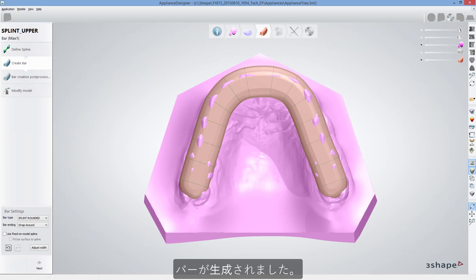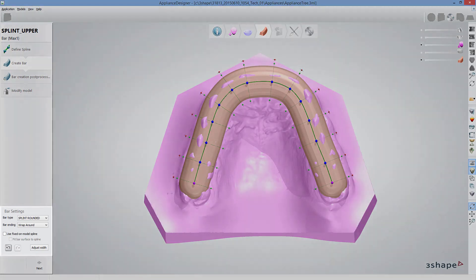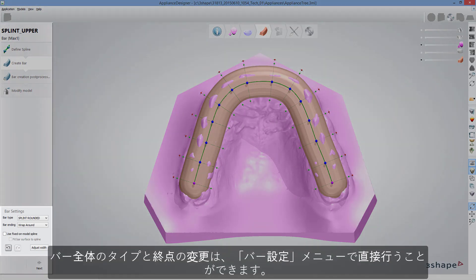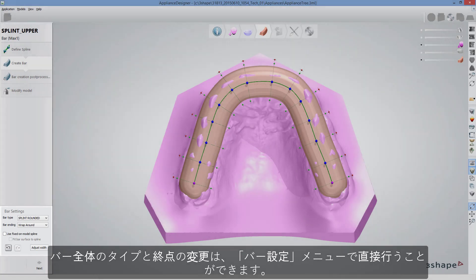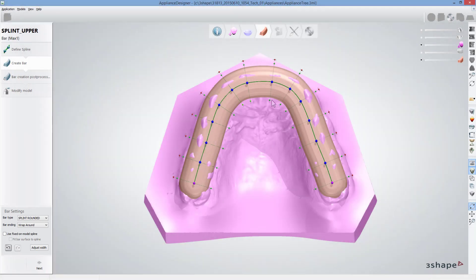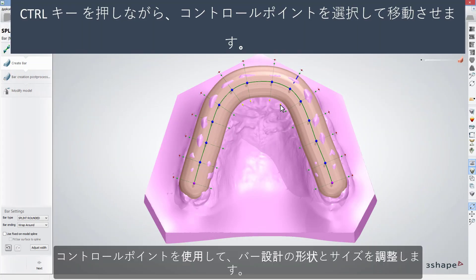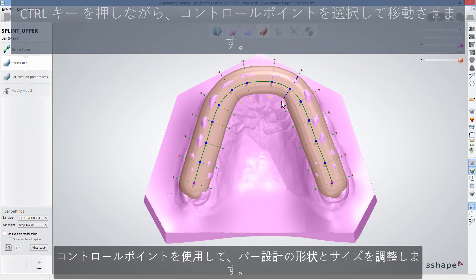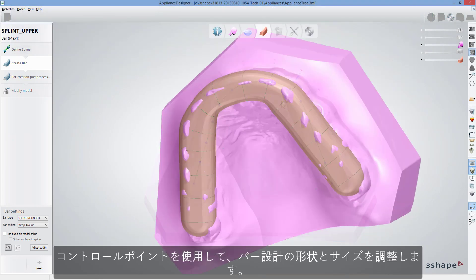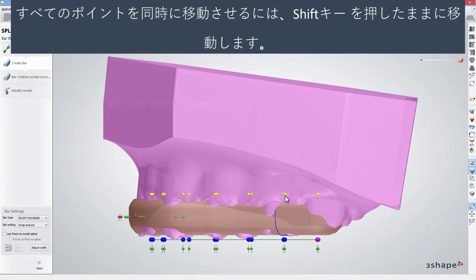Bar has been generated. In the Bar Settings menu, you can change the bar type and ending. To modify the bar design, use available control points to adjust its shape and size.